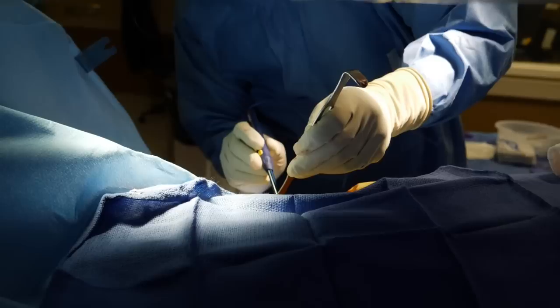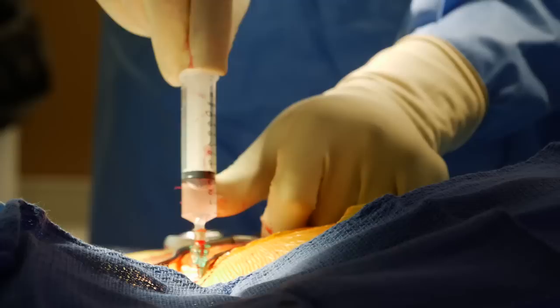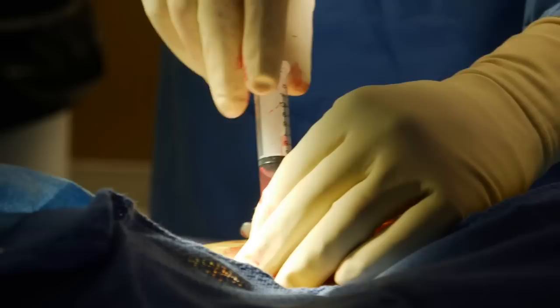We extend the incision down to the muscle using electrocautery. Then from the base of that insertion site, through the muscle, we use a needle to gain access to that large vein which we imaged. There you see our needle coming in from the right — we're over the first rib. We get a little flash of dark blood that lets us know we're in the vein.